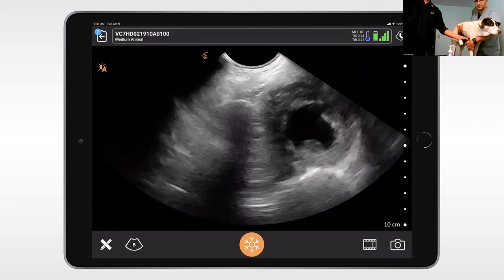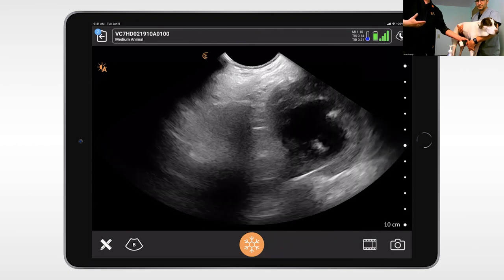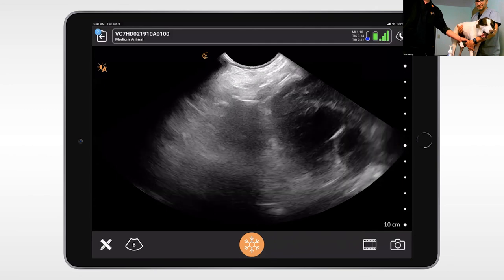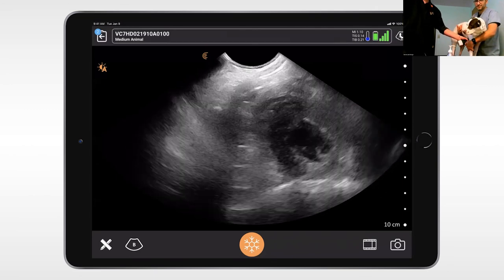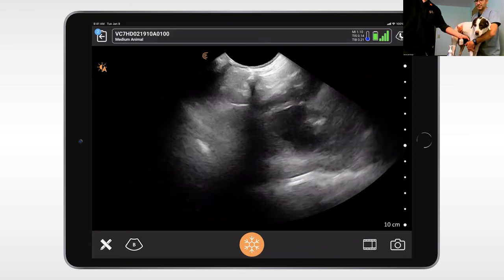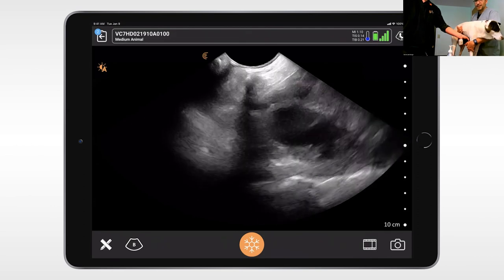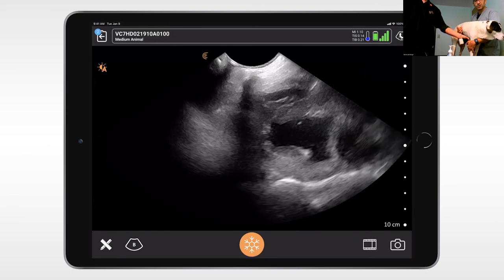So we're just going to pick up that mushroom view like you see right there, fan through that fish mouth, and then onto that left atrial ratio. Again, we are not cardiologists. This is how we scan most of our patients in the emergency room. We scan them in a standing or sternal position. And again, there's my four chamber view where I get the left ventricle and left atrium in the far field and the right ventricle in the near field. Definitely something that everyone can do. It just takes practice.